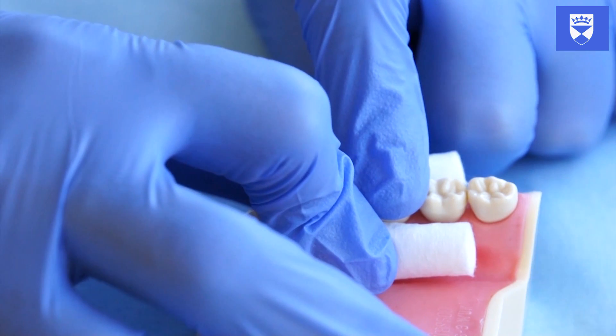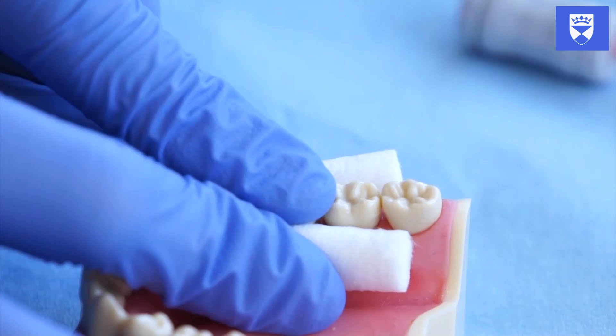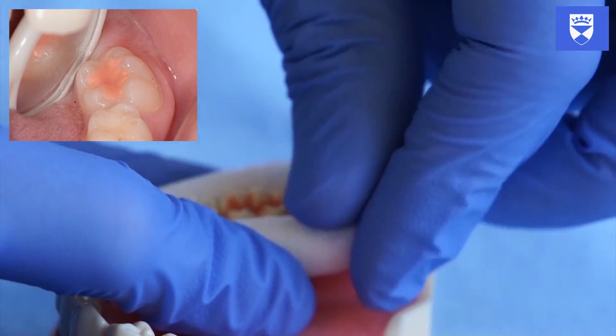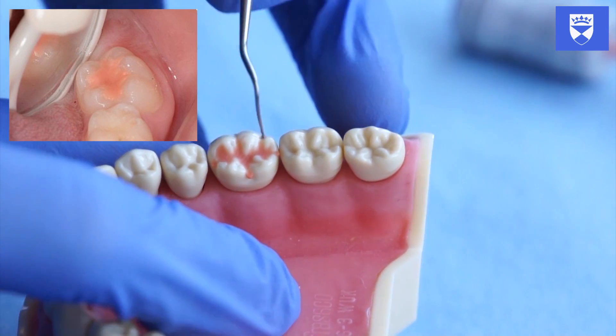This prevents exposure of the glass ionomer to moisture. Remove your finger and quickly examine the sealant while still maintaining moisture control. The sealant should appear to fill the fissure pattern and follow its shape without being too bulky. There should be no voids or defects.